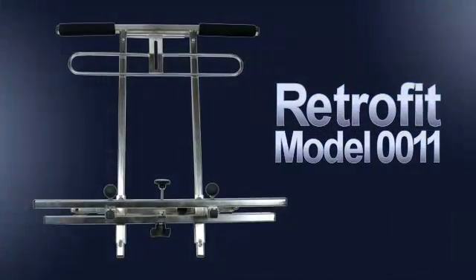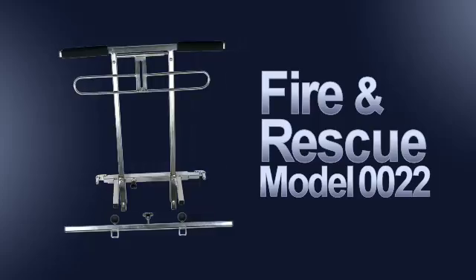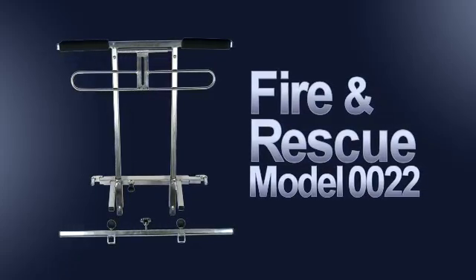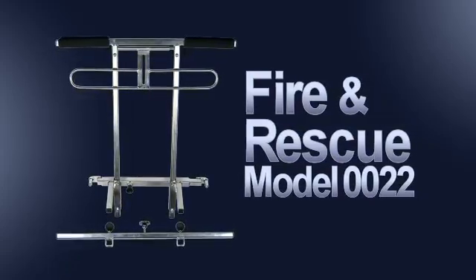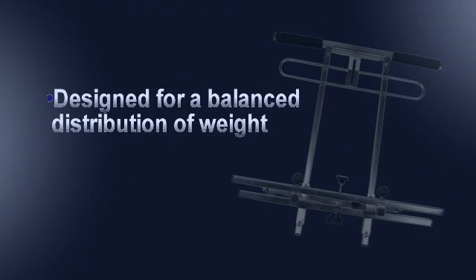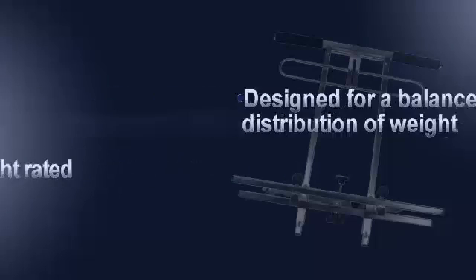The retrofit model firmly attaches to and remains on the manual wheelchair. The fire and rescue model can be quickly attached and removed for urgent transport needs and collapses for easy storage. The EasyLifter design provides a balanced distribution of weight and has been tested to withstand up to 880 pounds of weight.